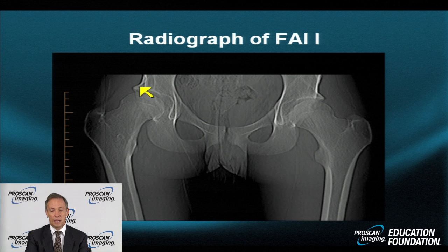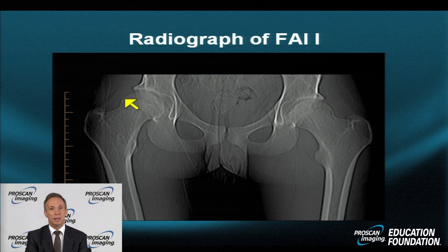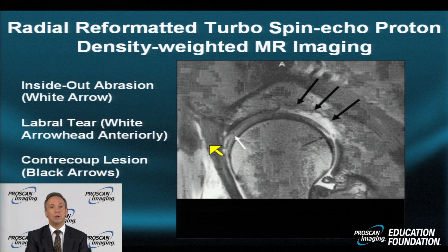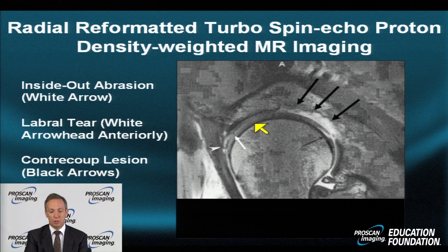The second finding is insufficient coverage — the horizontal, upward-sloping nature of the acetabulum that does not sufficiently cover the remainder of the femoral head on the right, nor on the left, but it's more severe on the right. This water-emphasized proton density fast spin echo image shows a segment of normal hyaline cartilage including both femoral and acetabular cartilage.